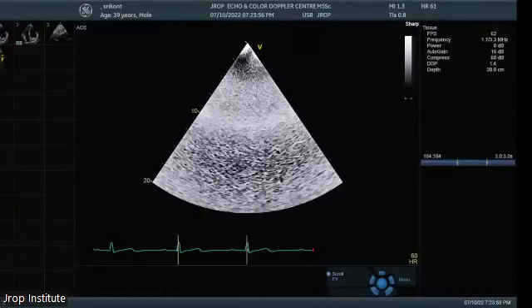Dr. Archana Sinalkar. Give me 5 minutes of this. Any other question on these windows? Because then I'll be talking about color Doppler, pulse, continuous wave, movement of these windows, peak gradient, mean gradient.